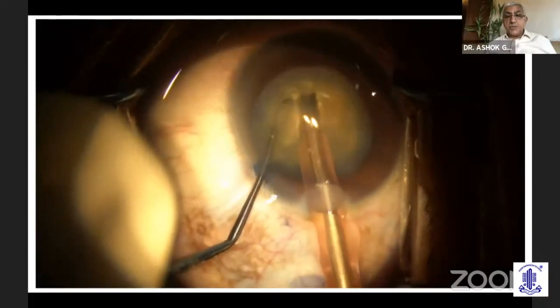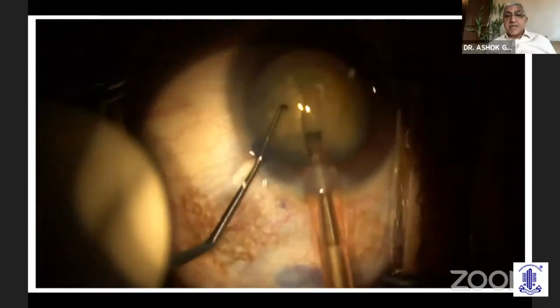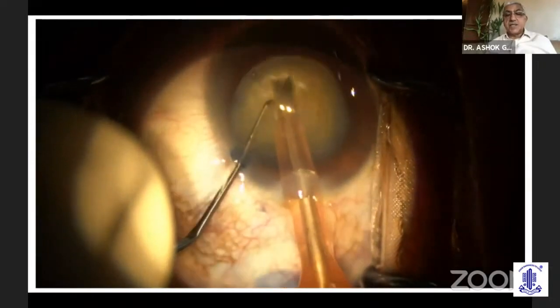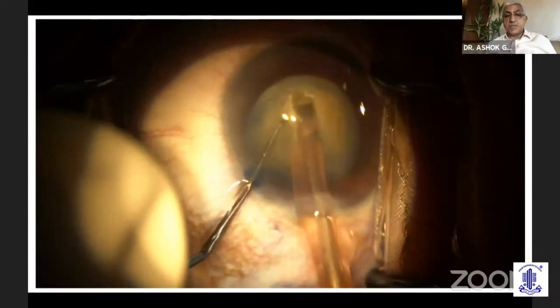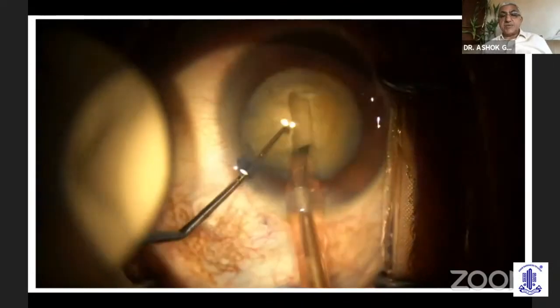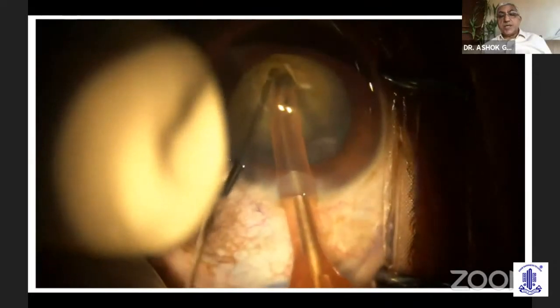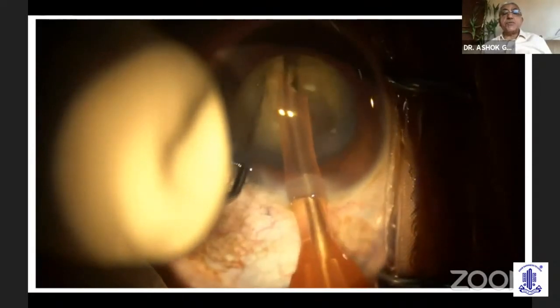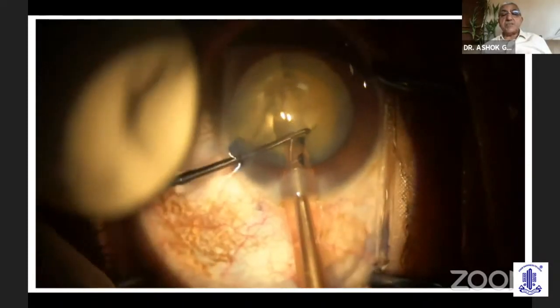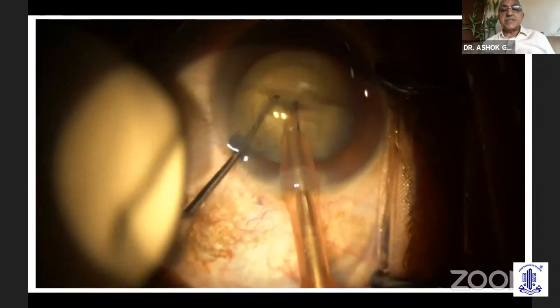So all that I want to do now is to make a really deep trench, so that when I separate the nucleus and break the posterior wall of the nucleus, that's the most risky part, when I would use either centrifugal forces or increase the intralenticular pressure enough to cause the break to extend. So I go at multiple points, go to the full depth of the trench, and then do a separation of the nucleus. It is fairly hard and breaks with difficulty, but when I do it from multiple points, I have succeeded in separating it. The movement is good.